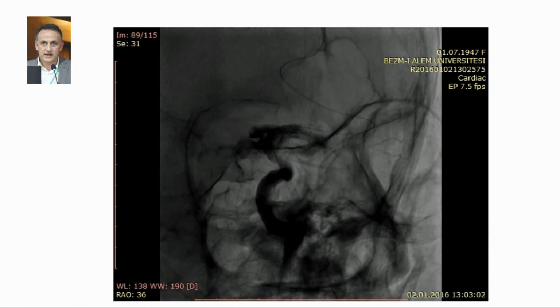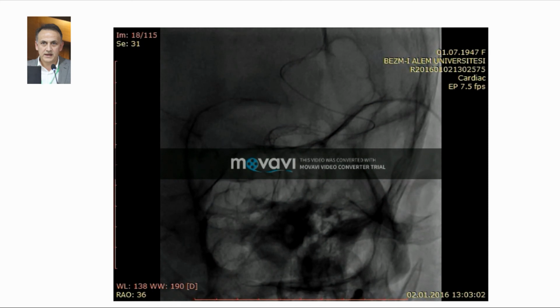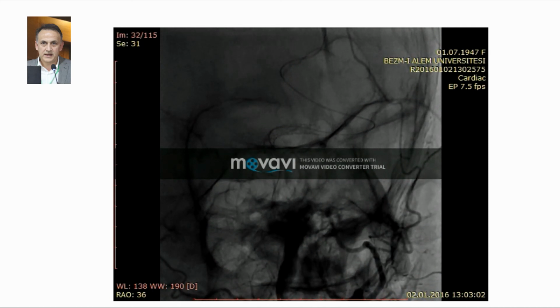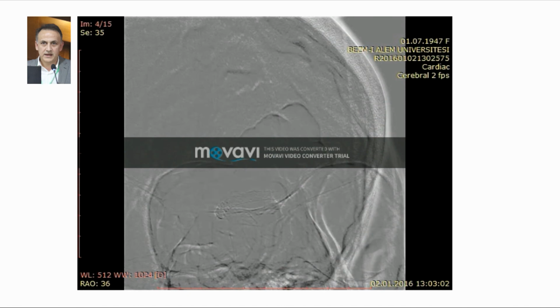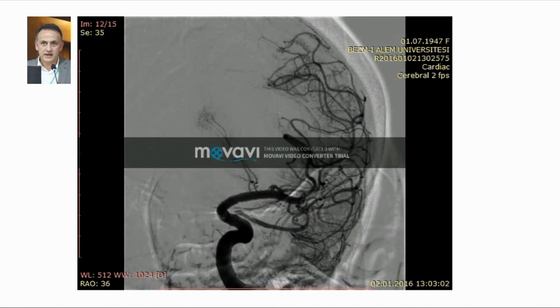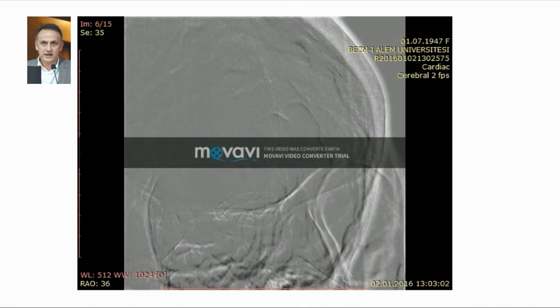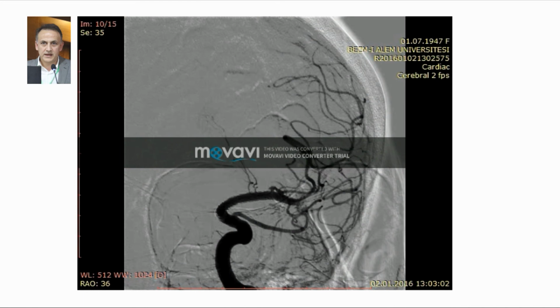It's a perforation. But luckily enough, as in coronary, they did balloon dilatation here for some time, I don't know how, and after that, they have this image. So I don't know how often this happens, but it seems that the perforation sealed completely.